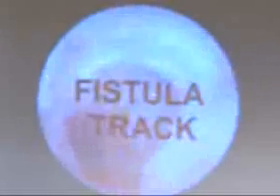This is again the fistula track, how it looks when we push the fistuloscope. This is again granulation tissue, necrotic tissue all around, one can see. There's just one thing I want to show. At times we also encounter some associated pus cavities along with this fistula track. We also coagulate those pus cavities and take care of these associated tracks also.